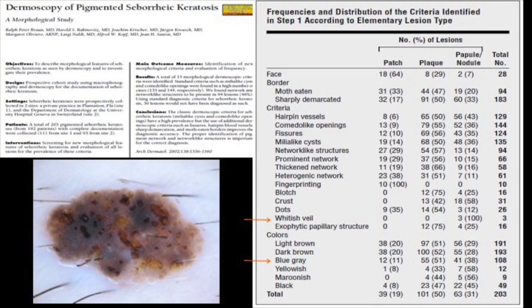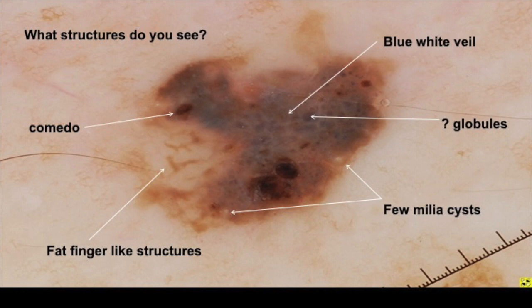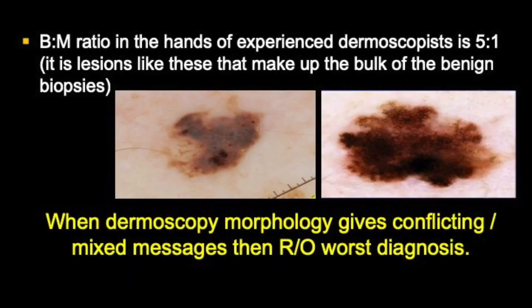They may not have the features that we have described in a seborrheic keratosis. It may be a different variant, like a melanoacanthoma or a clonal seborrheic keratosis, different types of seborrheic keratosis that are not easily recognized on dermoscopy and cannot be recognized on dermoscopy. And those end up being biopsied. So here's an example of a lesion that has features that you just don't really know, right? There are some features here that could be consistent with seborrheic keratosis, some features that look more like globules and bluish globules. And so in such lesions, you have to biopsy. And it's very interesting, and basically this is just to highlight that dermoscopy has its limitations.